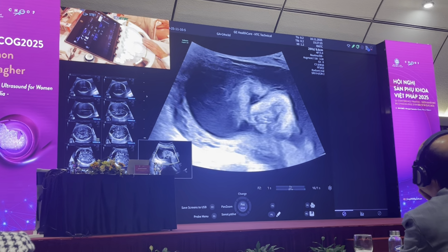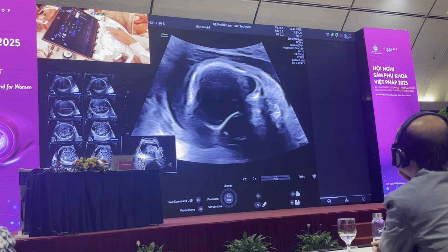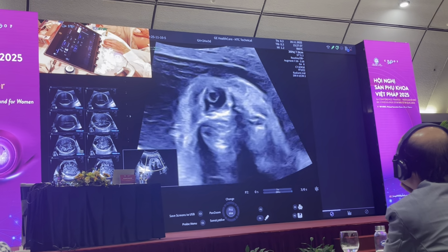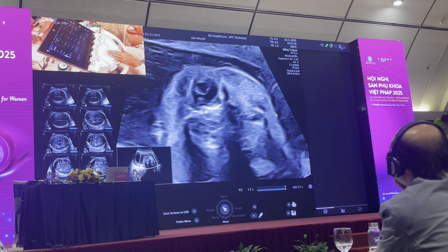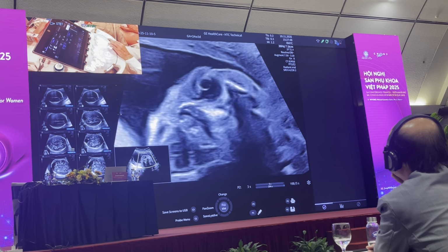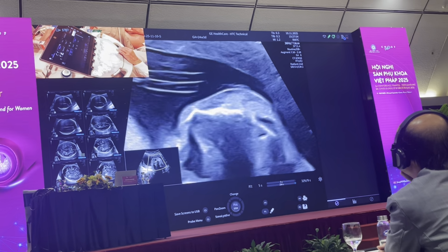As I magnify the image, I see the lower and upper eyelid in this position here, and then through into the lens, making sure that there are no cataracts. I also look at the posterior aspect of the eye, looking at the retinal nerve to make sure that there's not any retinal abnormality. This looks like a normal retinal nerve. As I come around posterior to the back, I look for any colobomas. As I look at the eye, I can see what looks like a normal eye appearance.